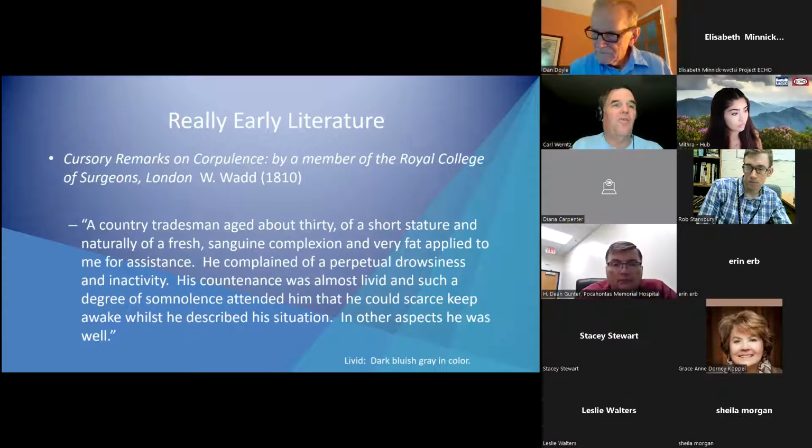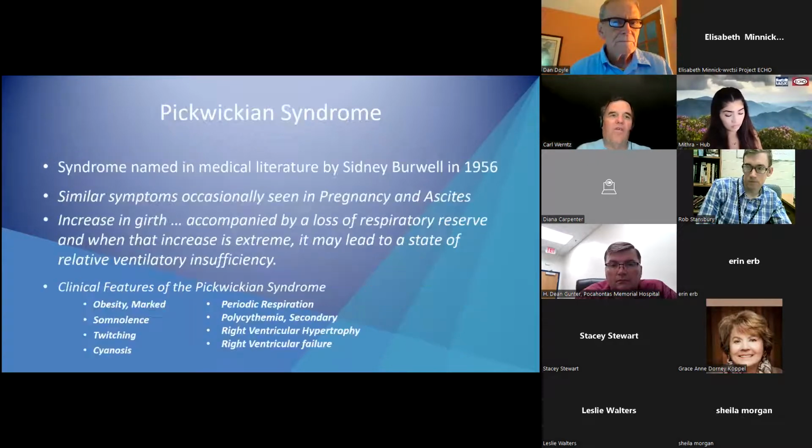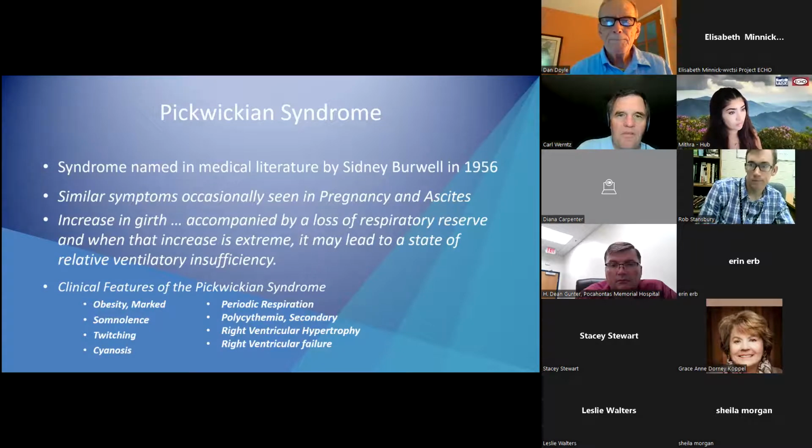They didn't talk about the pathology. In 1956, they would have had cardiograms. Ah, okay. So this is based upon the testing they could do in 1956. This would have included a cardiogram and a blood count. Okay. Thank you.